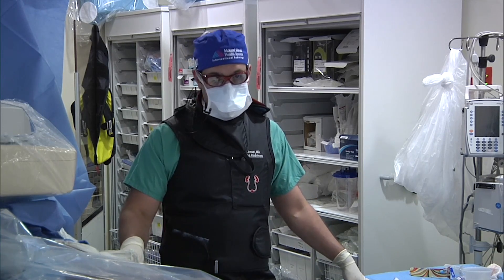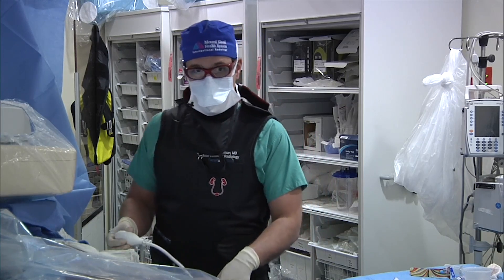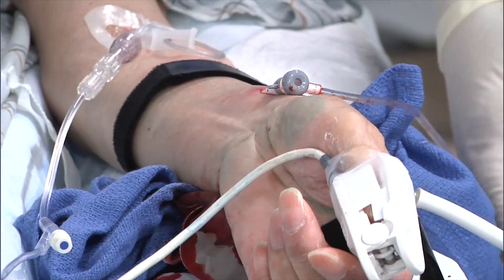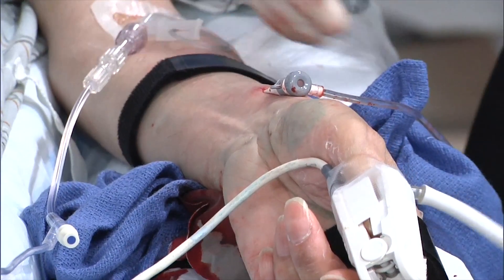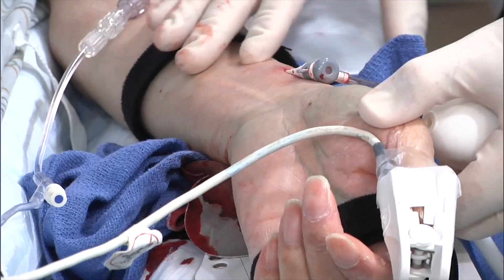So we're going to take a look at the wrist here. I want to show you guys a few things. We could zoom in. Can you guys see the wrist? This wrist was positioned with this device, the V-align positioner, which you guys can see outside.